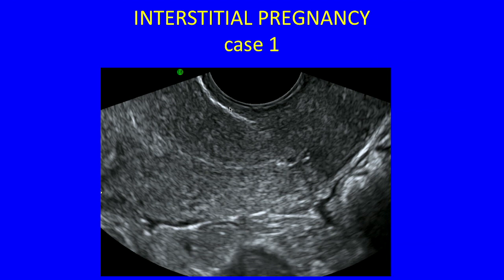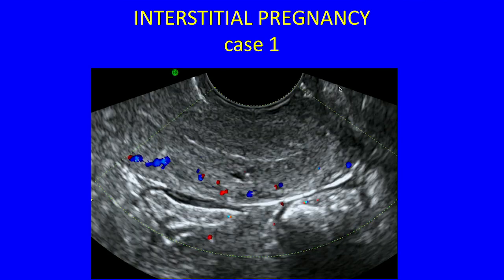If you see this white line, it's always the same. This white line is where the bladder attaches to the uterus. And if you look down from that, this is the level of the internal os. The internal os will be there. So the cervical canal is there, and the endometrial cavity starts there, going that way. So always look for that line. So you can see it's an empty cervix, absolutely nothing there.